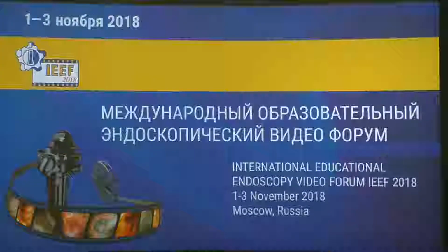Yeah, actually, we have sometimes tried underwater EMR, particularly for lesions located near the appendiceal orifice. In that case, using the underwater technique, we can see the demarcated line near the appendiceal orifice. So in that case, underwater EMR can be effective. I think that except for that, we prefer using the conventional EMR technique or ESD technique.